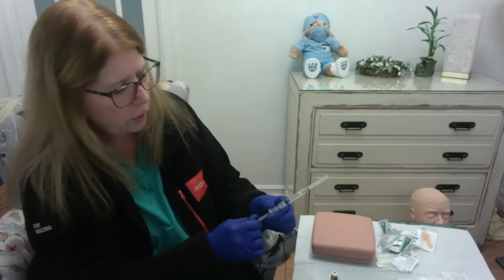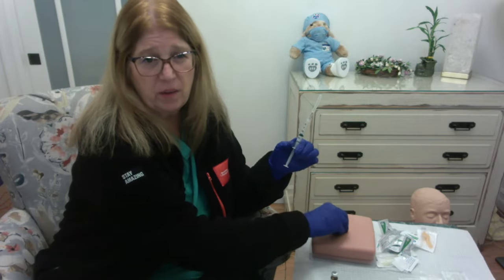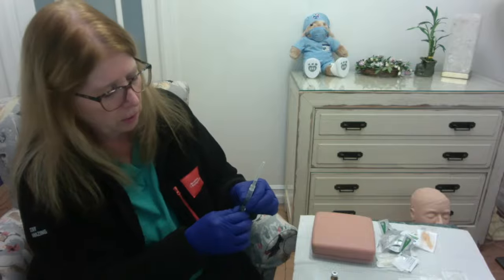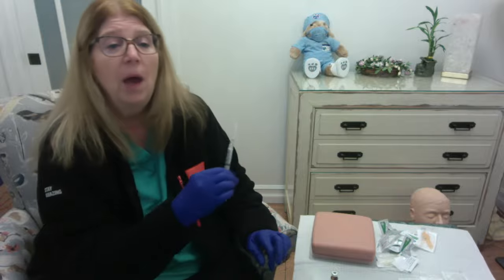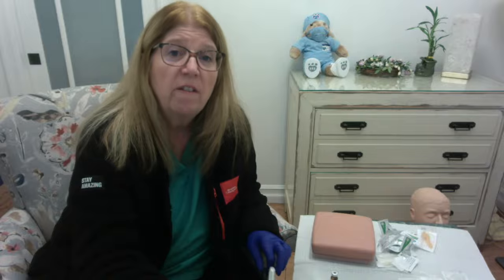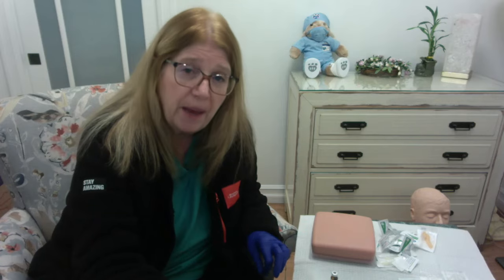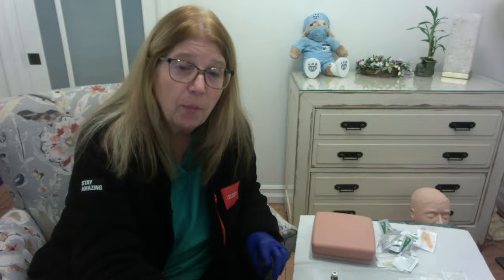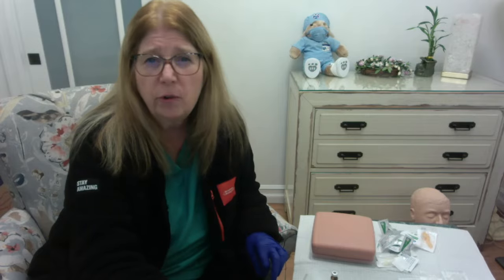And you'll notice that I'm squirting out the liquid. That's because I can't put liquid inside of these, okay? So that's why. All right, so I'm choosing my site. It's 2 milliliters. I can't use the deltoid. Now, I will tell you that the safest place to give an IM injection is in the ventrogluteal area, which is that upper outer hip. The least effective and most painful and least safe place to give an IM injection is the dorsogluteal. And that's because there's the potential that you could hit the sciatic nerve, okay?